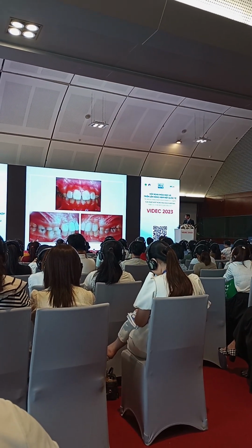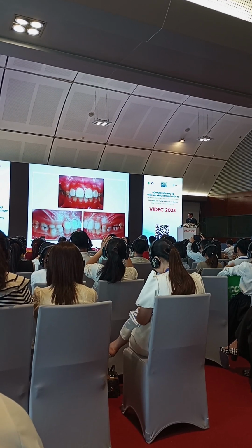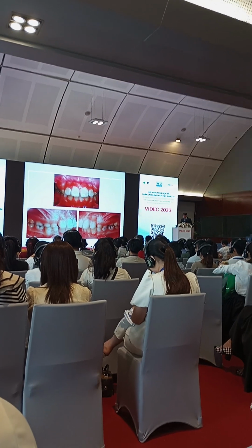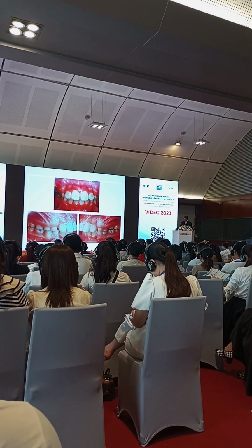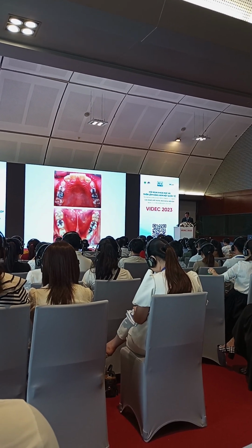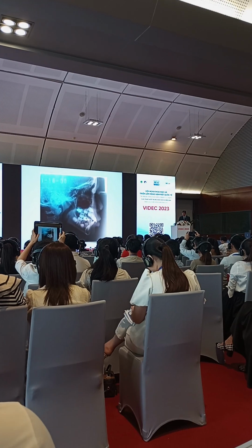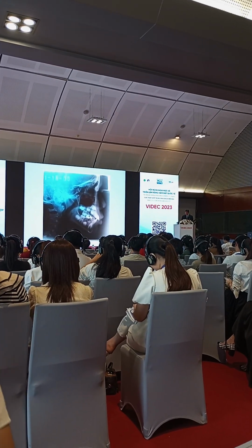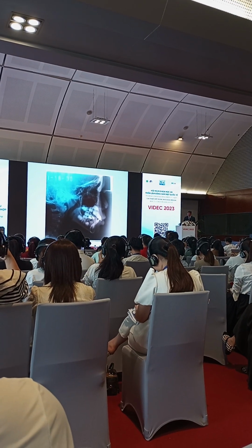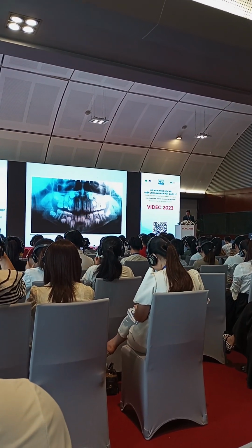Intraorally, only the 4 incisors and the permanent first molars are present. The rest are still in the deciduous dentition stage. So this is the occlusal view of the patient and the cephalometric radiograph, showing somewhat protruded incisors and a class 2 molar relationship.